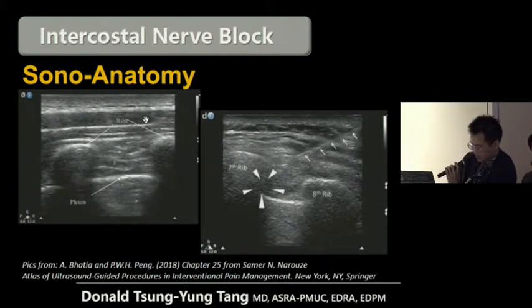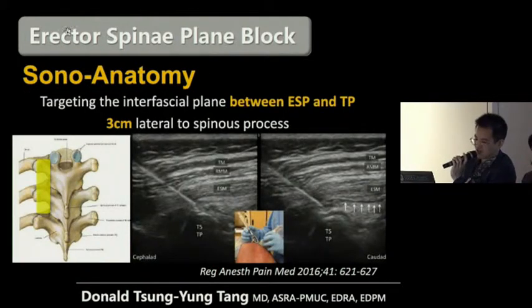Another novel technique is the erector spinae plane block. This technique is the easiest and safest technique around here. The technique is to find the transverse process at about the mid-thoracic level, and just dock your needle on the transverse process at whichever level you like. Give a small bolus to verify your plane is correct, then inject 20 or 30 milliliters or so.